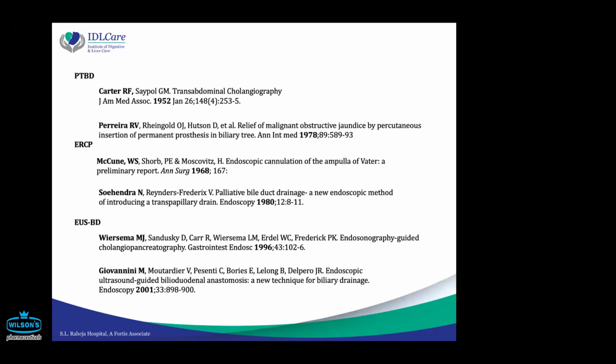So, EUS-BD is the youngest of the lot, and it has been put to the maximum test compared to the other two techniques, which is natural because it has arrived last, so it has to stand up with, not against, I should not say against, with the other two senior techniques.